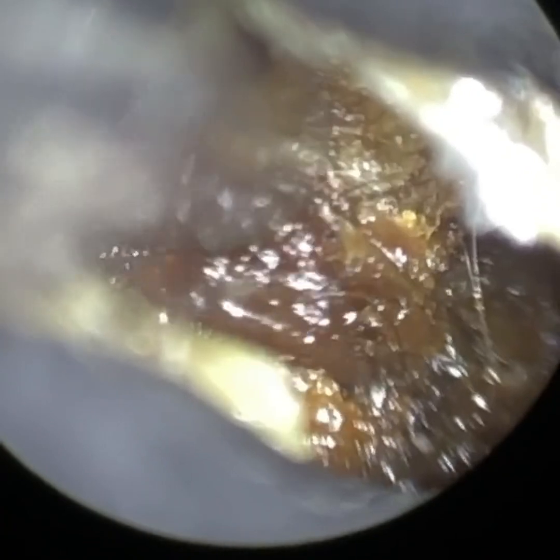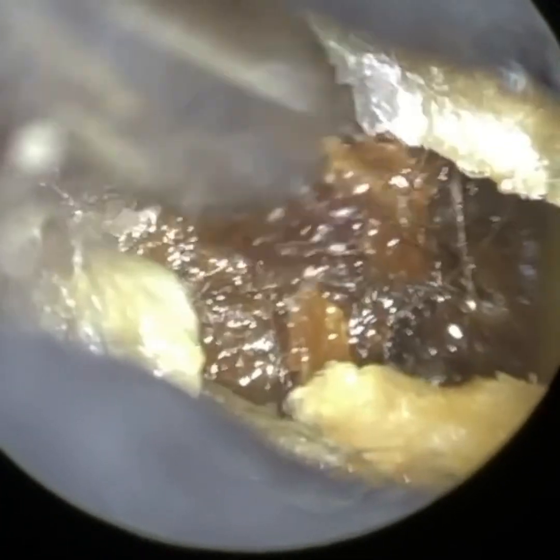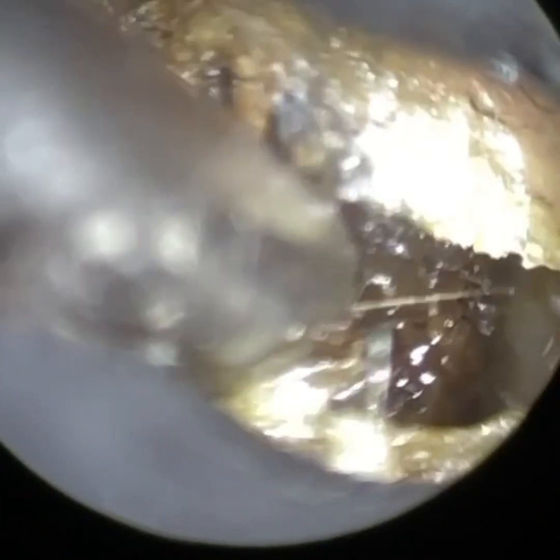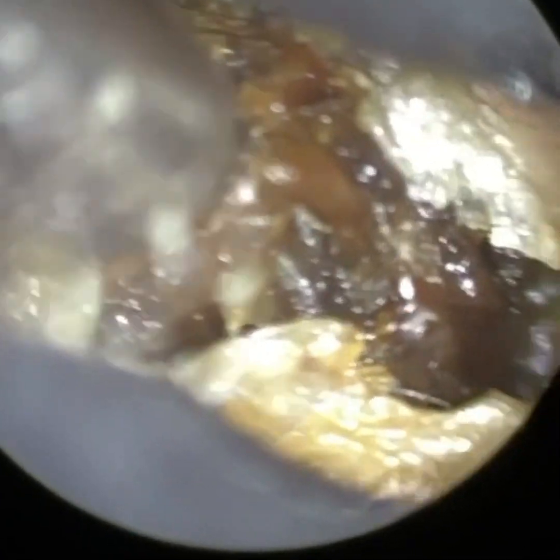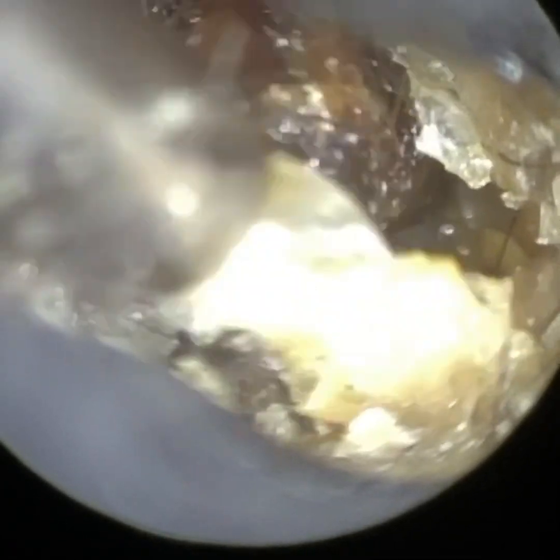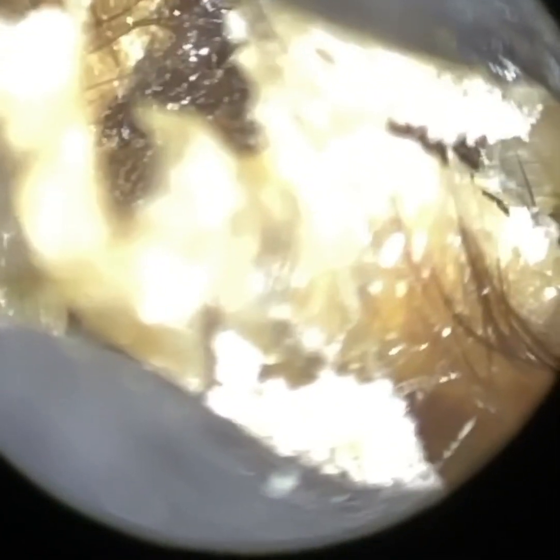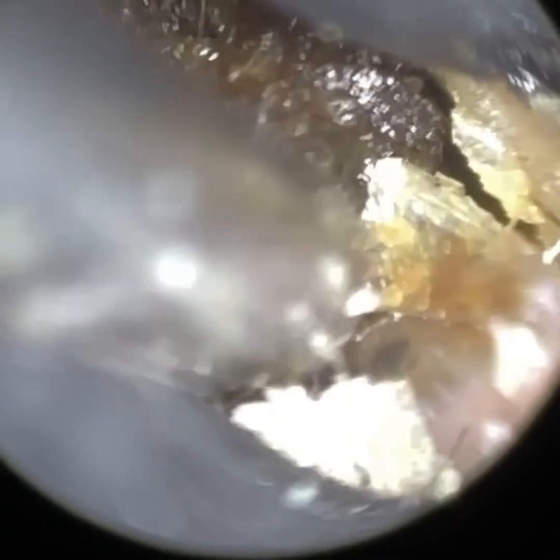With the Waxscope, it doesn't utilise binocular vision, which is one method of obtaining depth perception, and that's because, similarly to our iClearScope Endoscope, we're viewing the image on a 2D screen. However, depth perception is still available with the Waxscope because you're essentially using the focus as a means of obtaining depth perception. I often hear that you're not able to obtain depth perception unless you're using binocular stereoscopic vision, but that's not true. You can get depth perception using monocular cues as well, using shadows and landmarks in the ear.